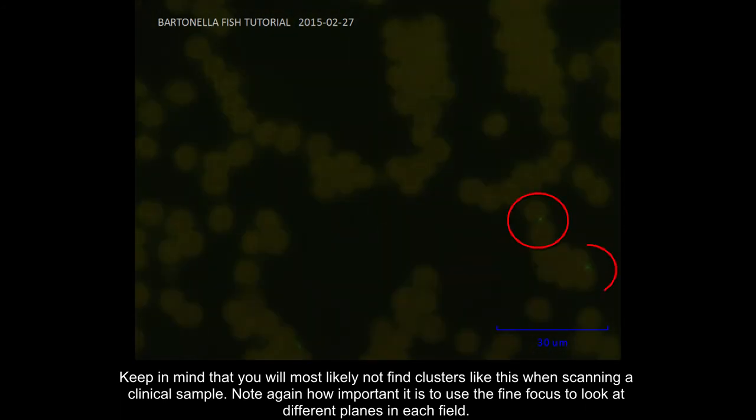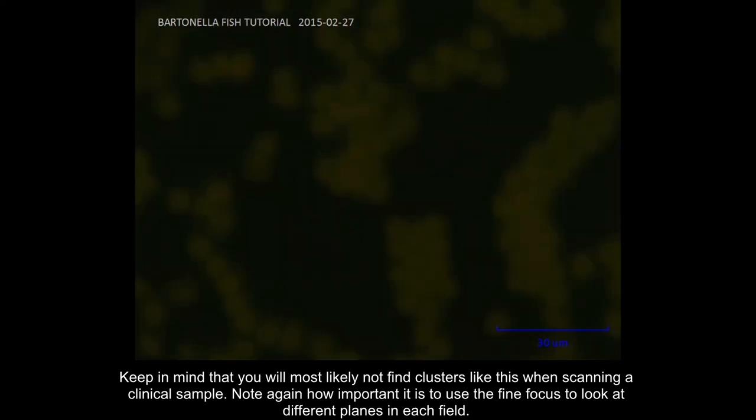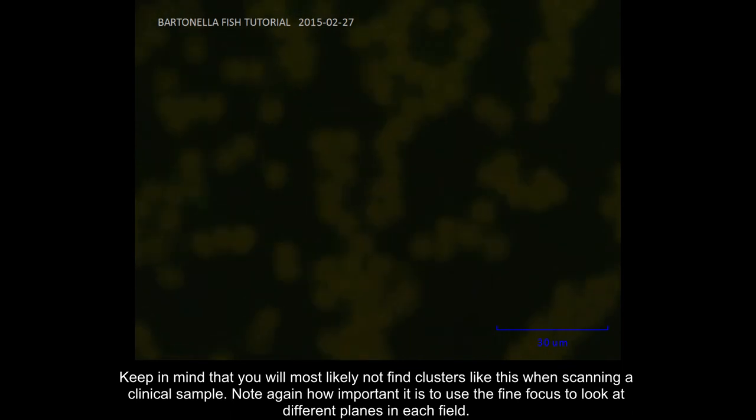Keep in mind that you will most likely not find clusters like this when scanning a clinical sample. Note again how important it is to use the fine focus to look at different planes in each field.